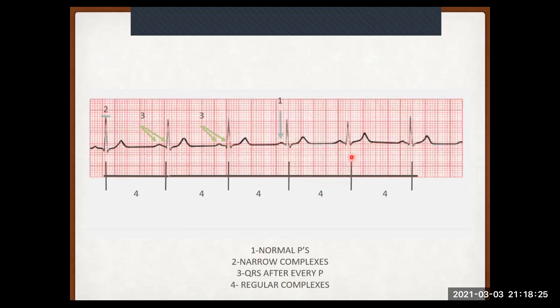Now, in saying that, we all have something that is called sinus arrhythmia. What that means is, and you can check it yourself, breathe in, your heart beats a little bit faster, breathe out, your heart beats a little bit slower. That's called sinus arrhythmia. It's quite normal. You are supposed to have that. So you'll never have them exactly, but the time difference is so negligible that they should actually be quite, you know, regular when you look at them. All right. So that's why we call that a sinus rhythm.